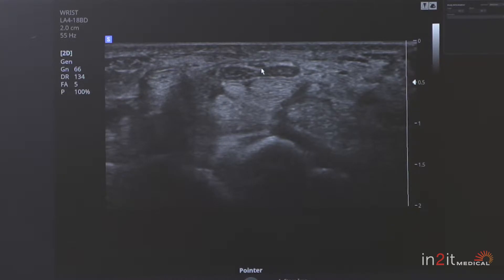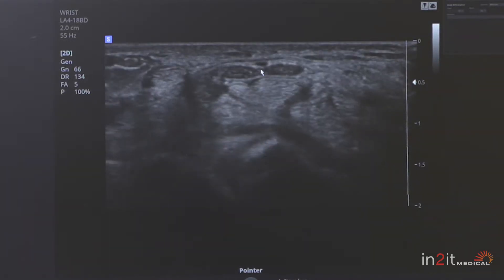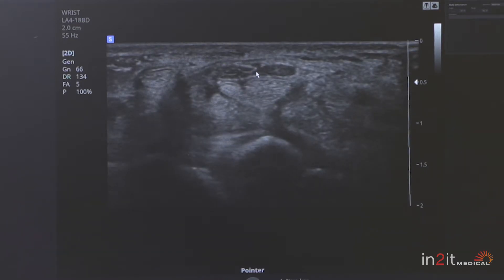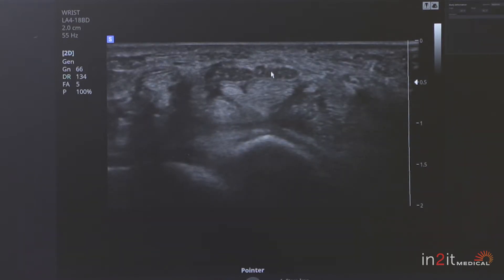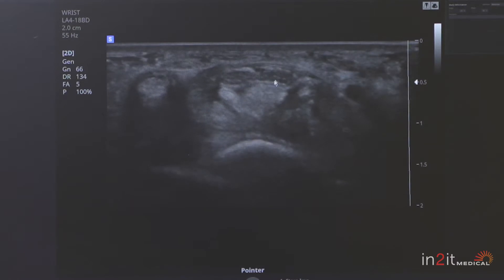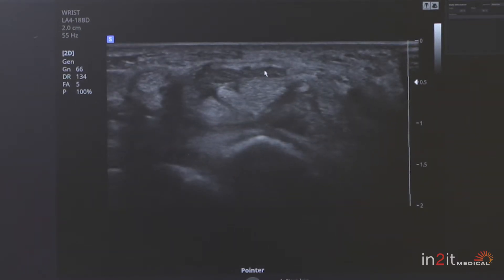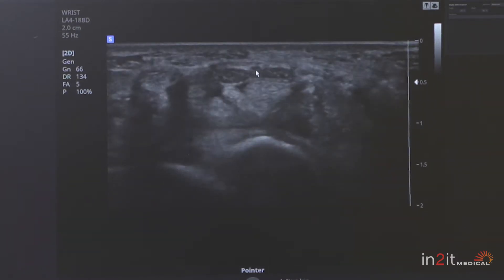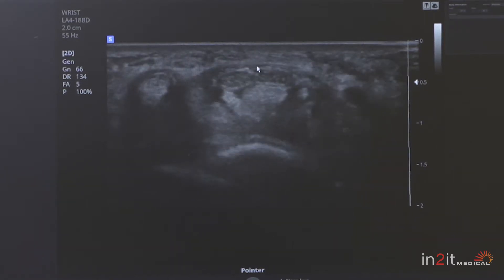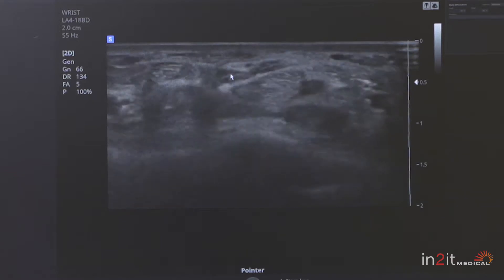It kind of splits into two bundles, and there's a structure right here. If we look closely at that structure, it's beating — that's actually called a persistent median artery. That's really good to know if you're going to have surgery because your anatomy is a little bit different. And then we have a nerve here and a nerve here. Generally in most people that nerve stays together, but this is a very common variation on the median nerve.